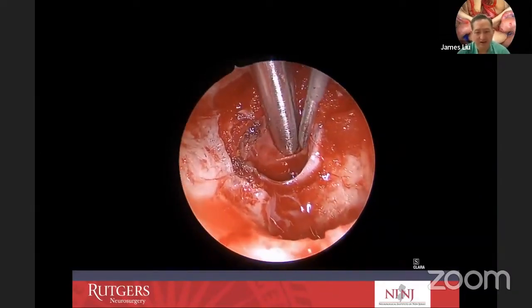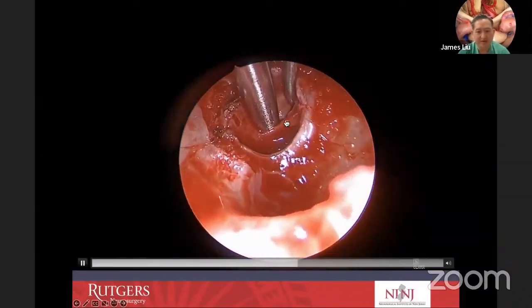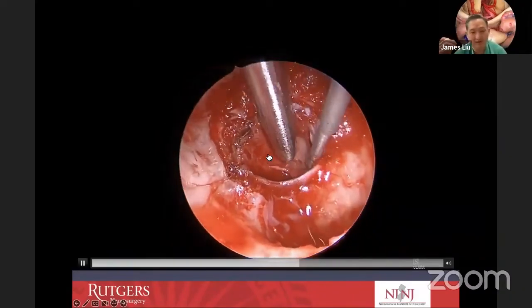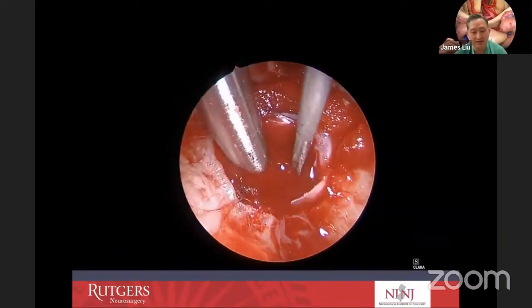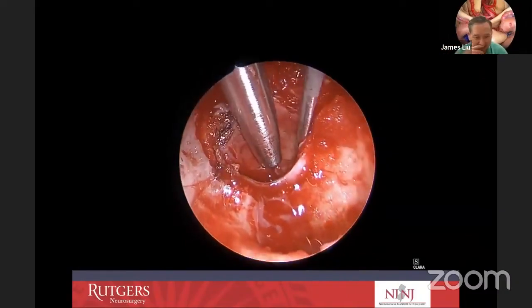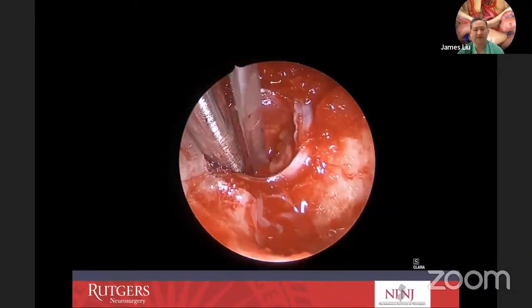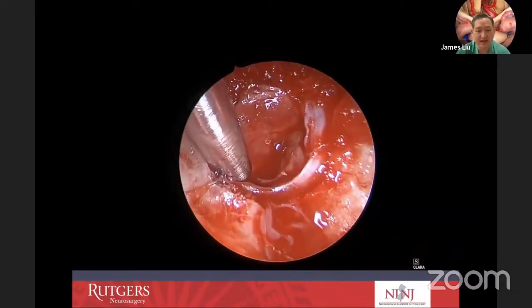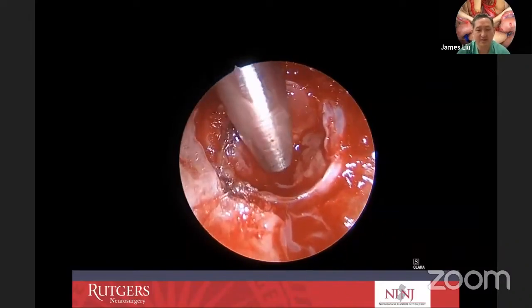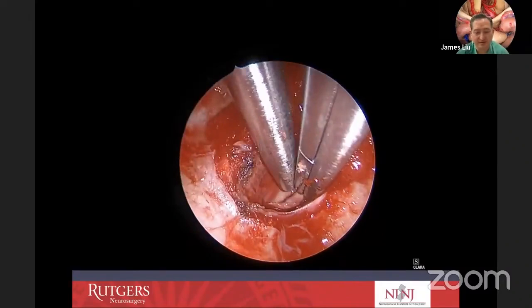And so here, we found the pseudocapsule. We've picked up a micro layer of the pseudocapsule that you probably could not visually see. But there is a pseudocapsule there. I had a suspicion there was one. And even if there was not, I was going to resect a rim of the gland anyhow to get a higher chance of biochemical cure. And so there is the pseudocapsule.